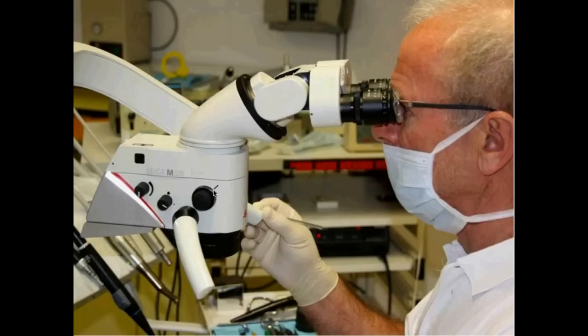Talking about magnification, what kind of magnification would you use in what speciality? What's the main magnification factor you are working with? 10 times. 10 times magnified. Okay. But doing endos, very often also 20 times. Okay. Yeah, I think this also answers the question with the loupes, because this is a magnification factor that a loupe cannot reach.